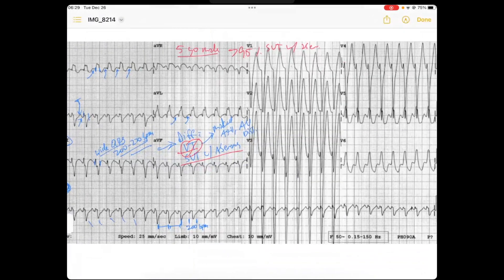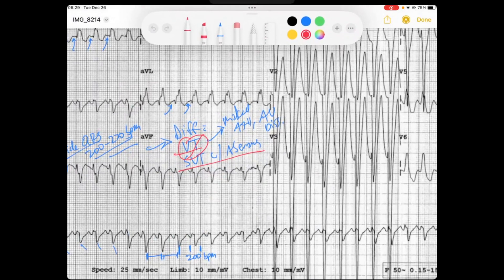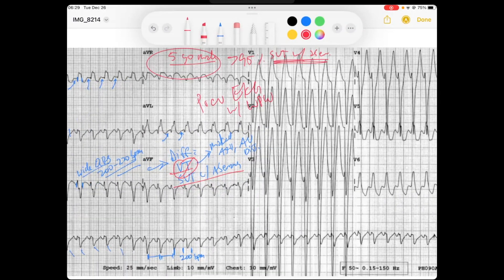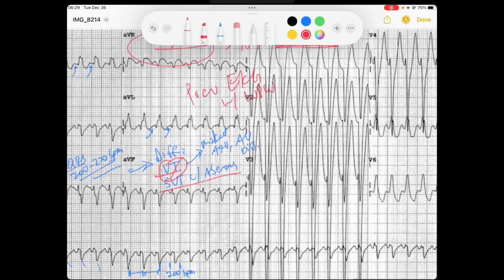With our clinical context and our previous EKG, we can say that this wide complex QRS is very likely to be an SVT with aberrancy. Based on the patient's age and because we know they have a previous EKG showing Wolf-Parkinson-White, we can be pretty confident that this is going to be antidromic AVRT.